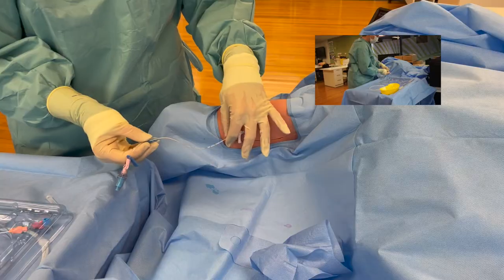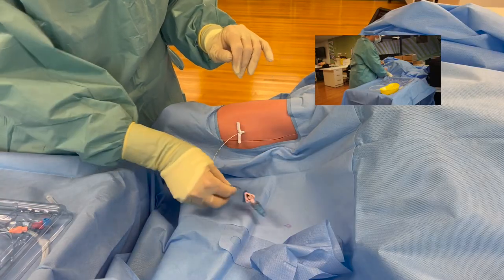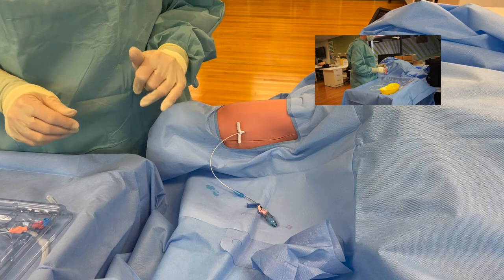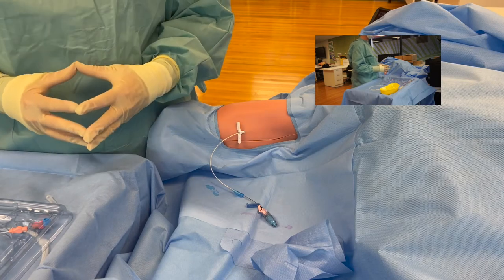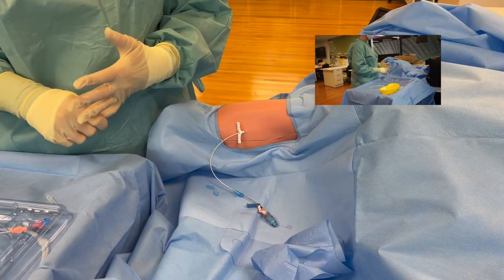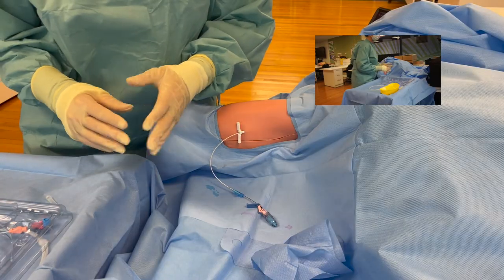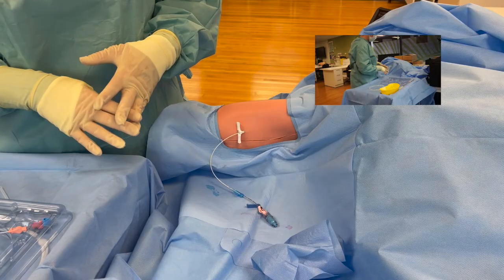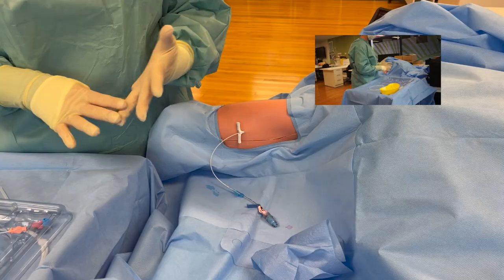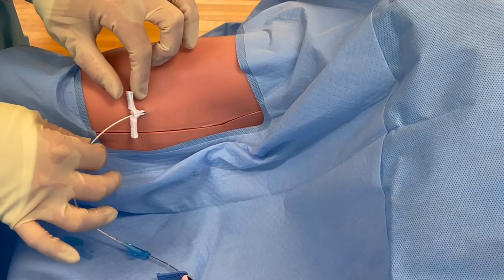You would have pre-measured your patient's chest to know approximately how far in it's going. I've placed it at 35 centimeters, which is approximately the internal length for an adult. At this point I would be making sure - or just a little bit earlier - that I had some tip guidance technology either available in the room or on their way. That might be in the form of radiographers bringing either an X-ray machine or a fluoroscopy machine.